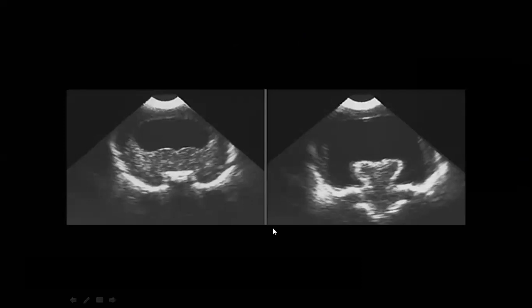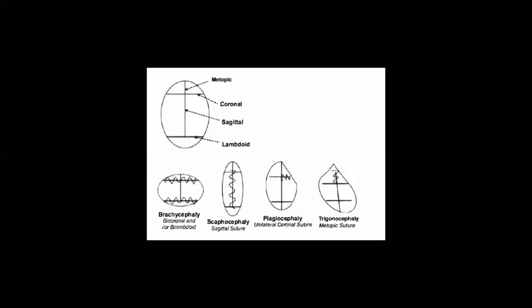Okay, alobar, yes. Alobar type with monoventricle, yes. One of the things that we like in MCQ, we are about to finish, one minute, and we will finish the session, and I think it will be the end of this neuro. Maybe next time we'll start musculoskeletal.